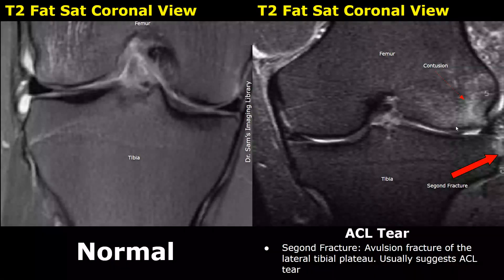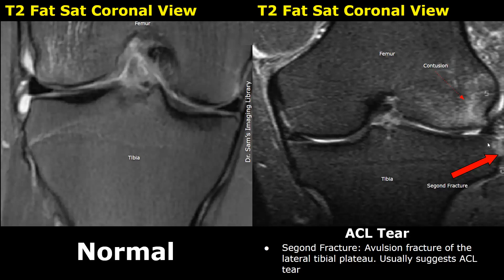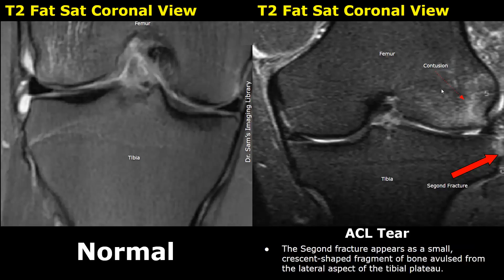A Segond fracture is an avulsion fracture of the lateral tibial plateau. An avulsion fracture occurs when part of the bone is pulled off by the ligament — due to excessive force, a small bone fragment is pulled away. Segond fractures are associated with ACL tears. This is the point of the Segond fracture in this image, and a bone contusion is also present. A Segond fracture appears as a small, crescentic-shaped fragment of bone avulsed from the lateral aspect of the tibial plateau.